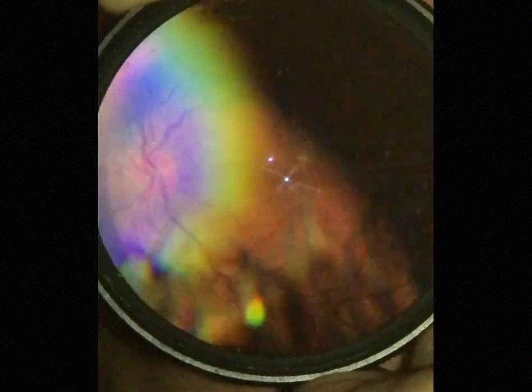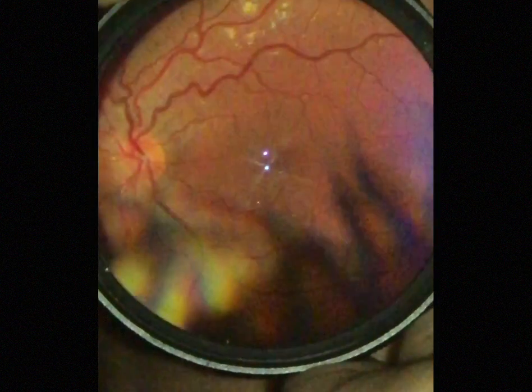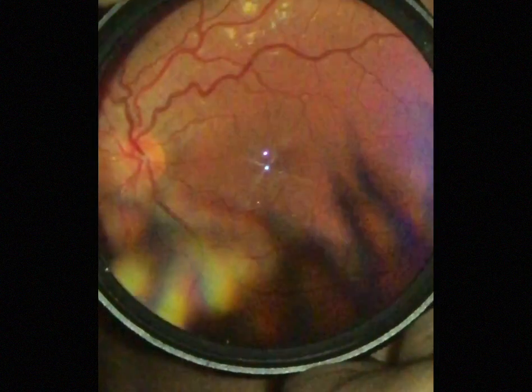It also allows you to adjust the exposure. It helps reduce glare, but also if you have a darker lesion in parts of the retina it can help you get better contrast off of it. You can think of it as the gain in ultrasound — if you want to bring up a lesion, sometimes you have to decrease or increase the gain, so you can think of the exposure that way.